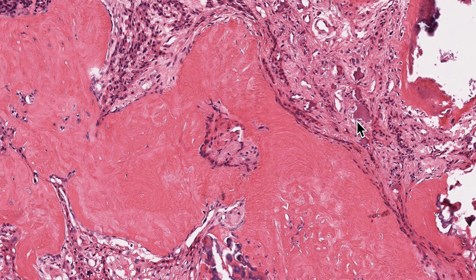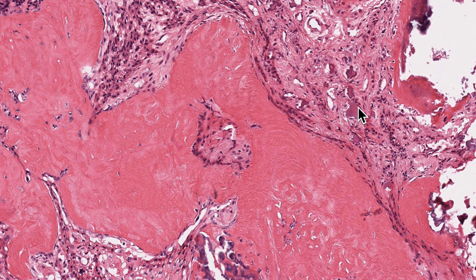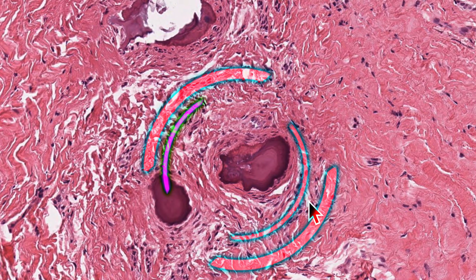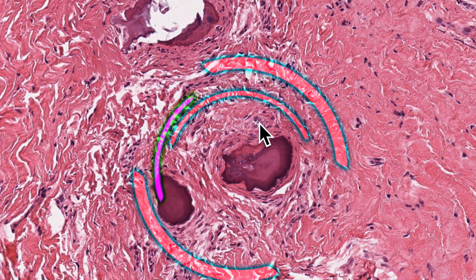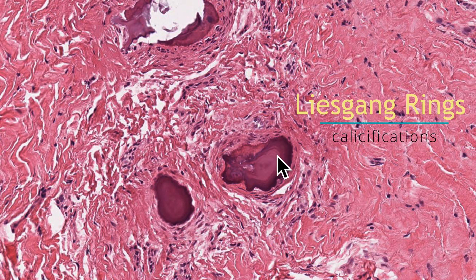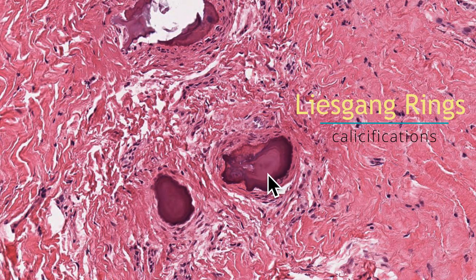Coming to the calcifications — these calcifications are globular, amphophilic, with a typical lamellated appearance or concentric rings of calcifications. Here we see two focal spots of calcifications and if you keenly notice, the calcification is happening by layers. This concentric deposition of calcium salts is what we typically call Liesegang rings of calcifications.